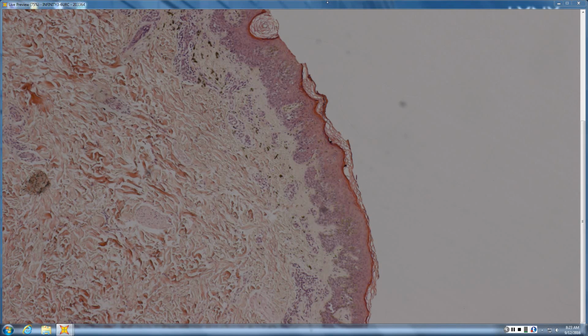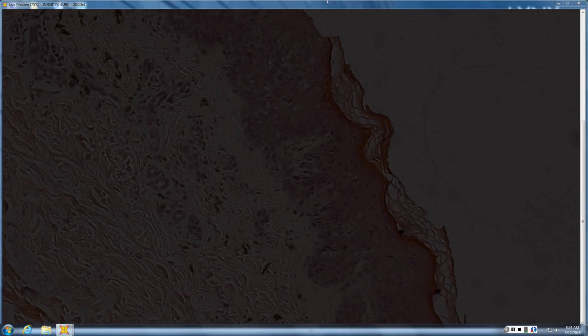So now there are a few possibilities. One is melanomas have to start somewhere, right? Two is there are poorly nested lesions that occur in young people, especially what's called the pagetoid intraepidermal Spitz nevus. They are relatively small epithelioid cells, so they're smaller than Spitz cells. They don't nest at all, or not to much of any degree, but they're small, they're well circumscribed, they're completely benign. You take any little piece of it and you can sucker most people into saying superficial spreading melanoma, especially if you put an immunostain, because they're all through the epidermis, but they're all uniform. They look like small Spitz cells. It's well circumscribed, and it's in a young person. And it's a recognizable benign entity. And this probably fits right into that.